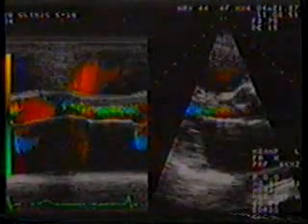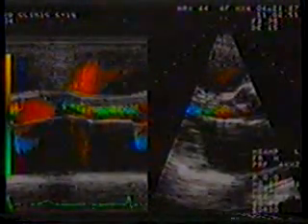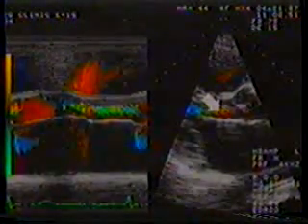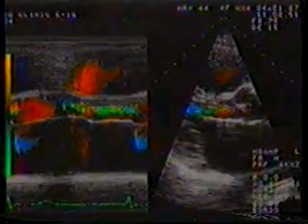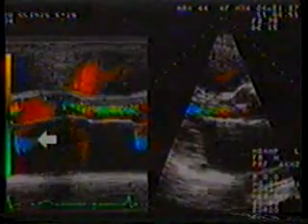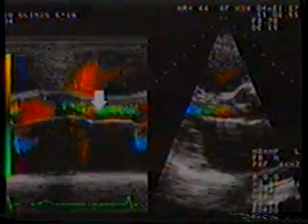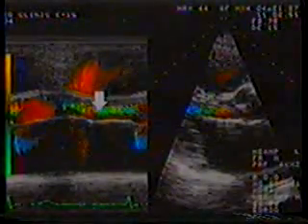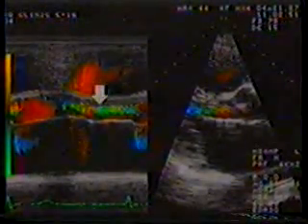Moving back to peristernal long-axis format, an M-mode cursor has been directed through the aortic regurgitation signals just below the aortic valve. On the color M-mode, mild mitral regurgitation is evident in systole. The aortic regurgitant jet is here. The color M-mode is a nice modality for assessing the width of the jet, as well as for timing of various events during the cardiac cycle.